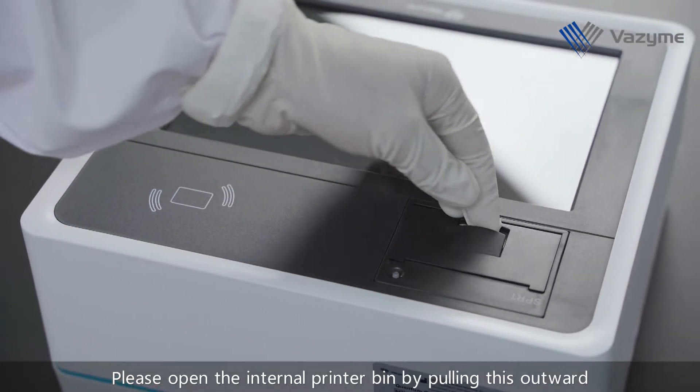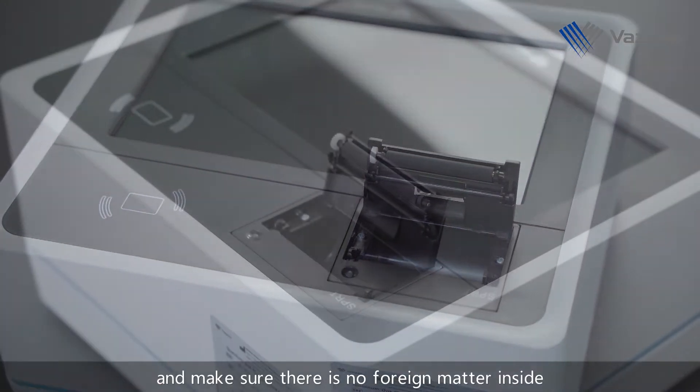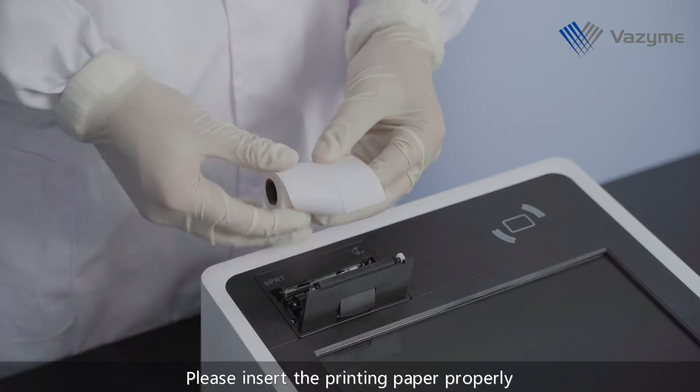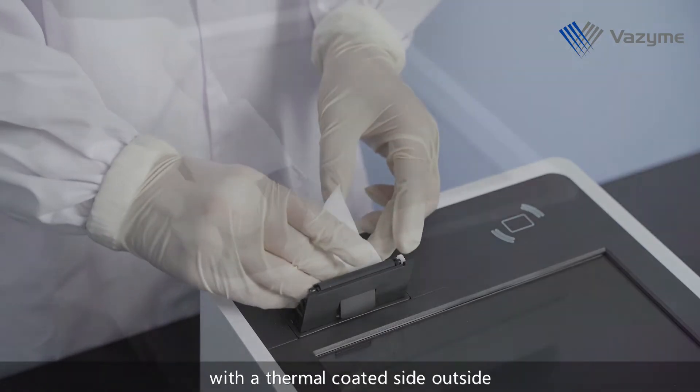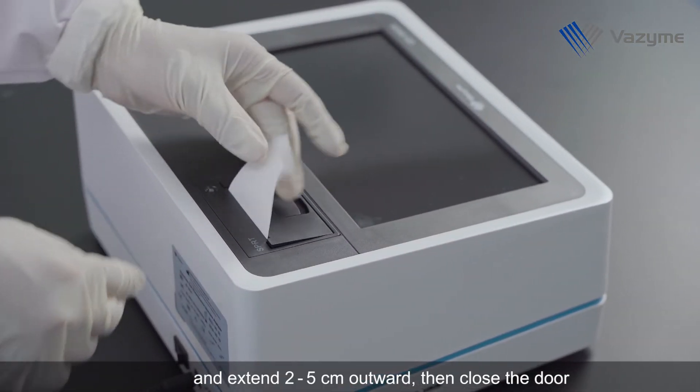Please open the internal printer bin by pulling it outward and make sure there is no foreign matter inside. Please insert the printing paper properly with the thermal coated side outside and extend 2-5 cm outward, then close the door.